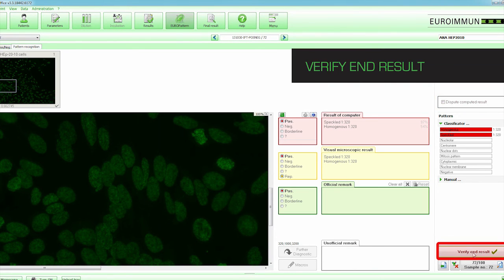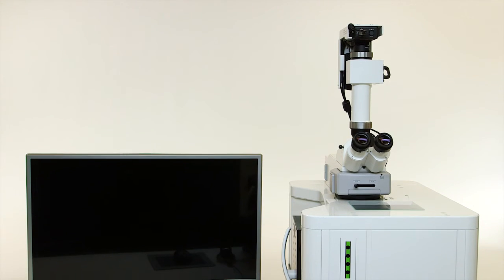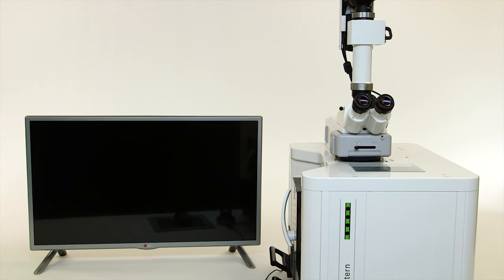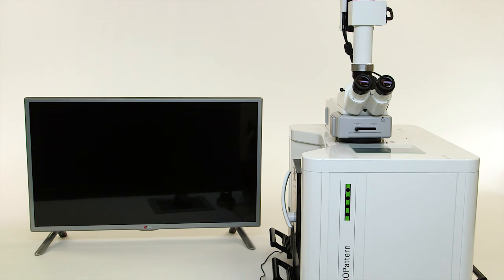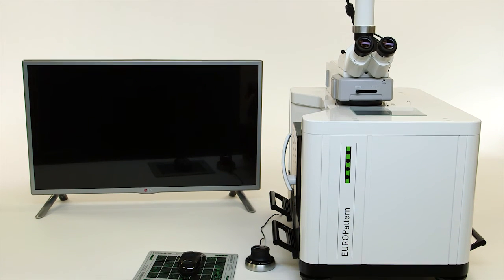By clicking on the Verify End Result button, the result is transferred to the final report. This concludes the Europattern demonstration video. Let's recap the features and benefits of Europattern.